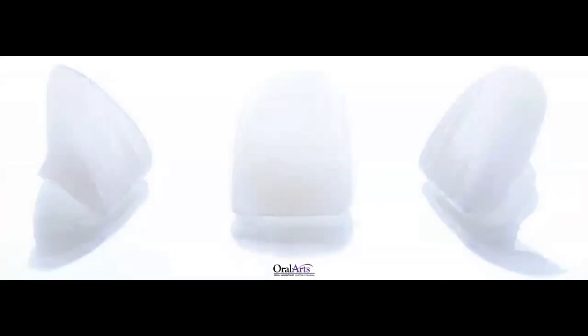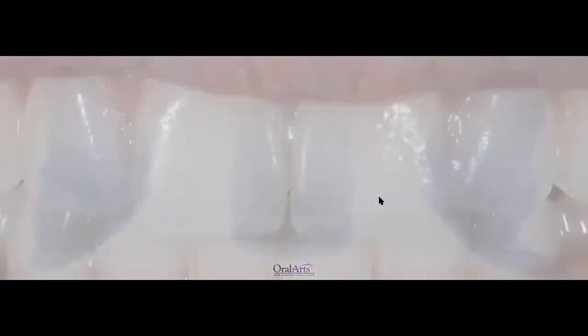Now, this is the final restoration. Look how thin this is. Look how translucent that restoration is on the cervical aspect compared to the incisal or middle third, because up here it was a very, very thin layer of ceramic. These are very delicate restorations. They're very strong once they're cemented, but they're very delicate before bonding. So please make sure that you're very careful with these restorations.